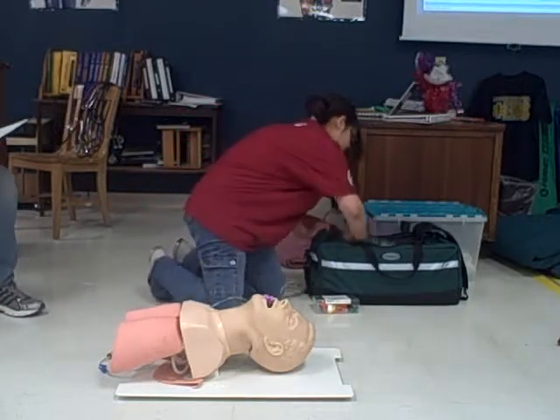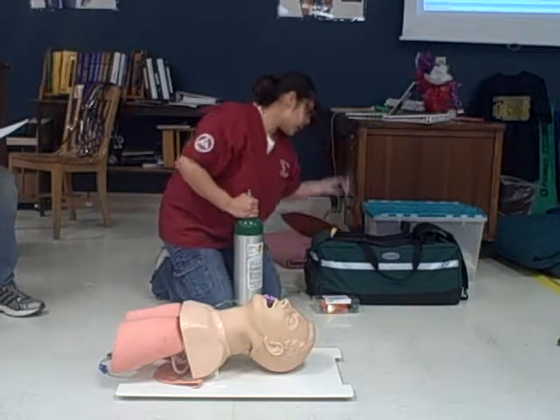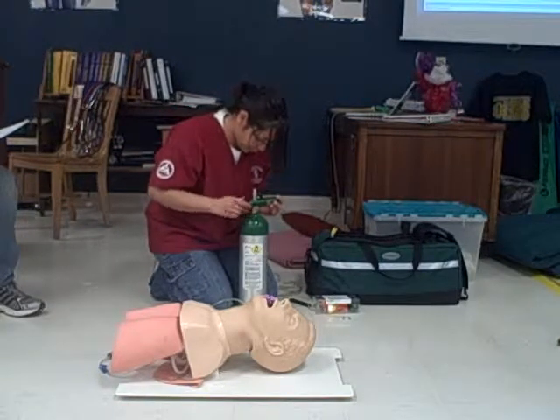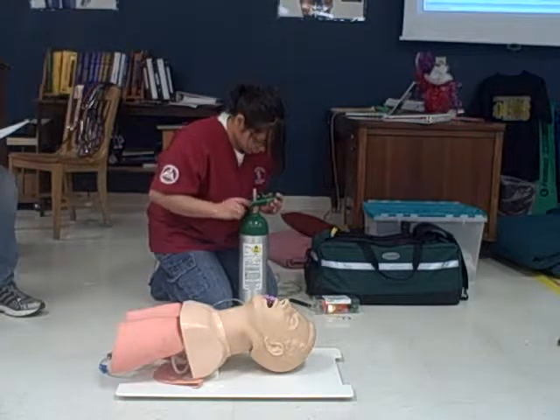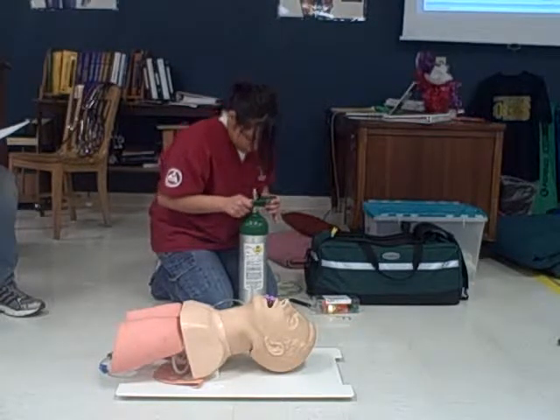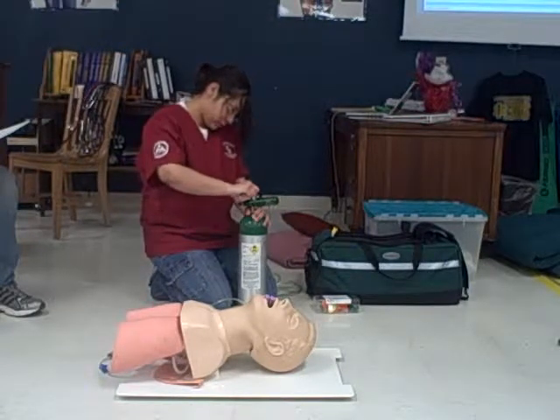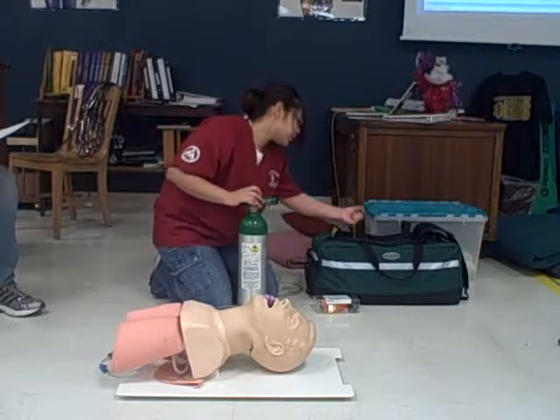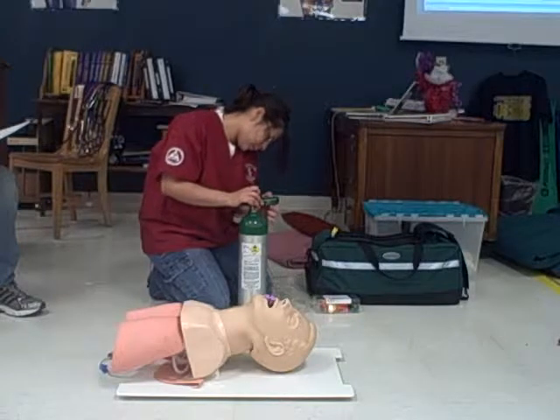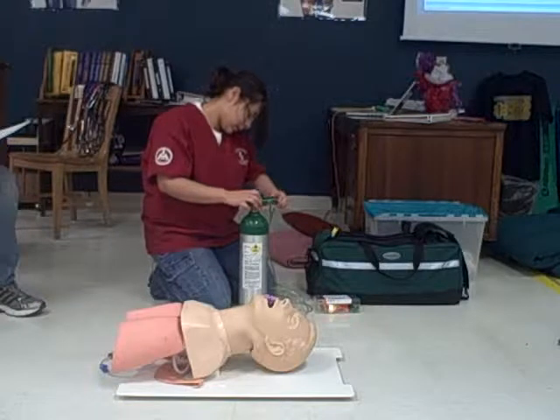I'll now provide supplemental oxygen. I'll set up my oxygen tank. My regulator should only be hand tight. I'll open it to check for leaks and for pressure. There are no leaks and my pressure is present. I'll connect the tubing to my regulator and adjust it to 15 liters per minute.